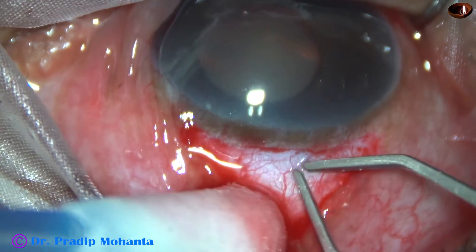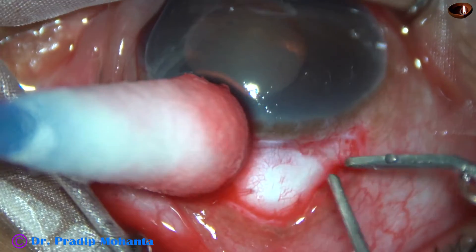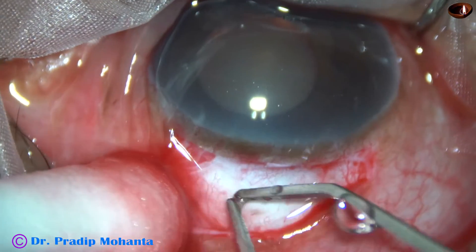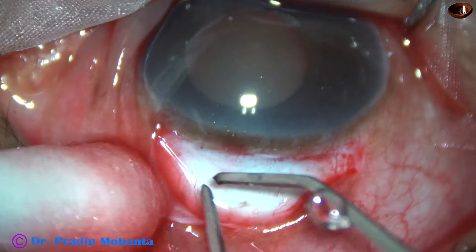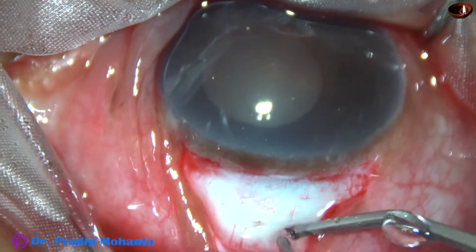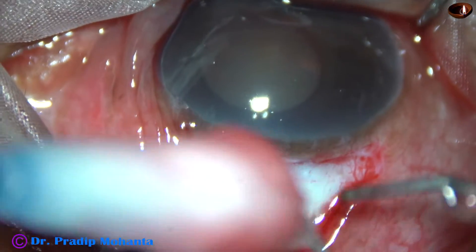Now bipolar wet-field cautery is being done. The assistant keeps on instilling drops of BSS as I do bipolar wet-field cautery. So the cautery is almost done.